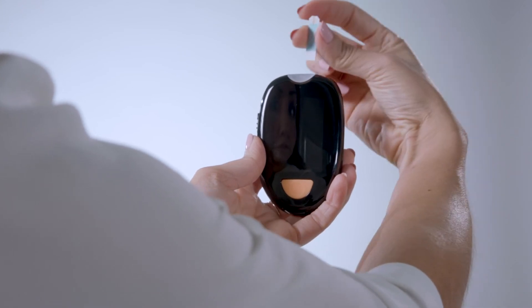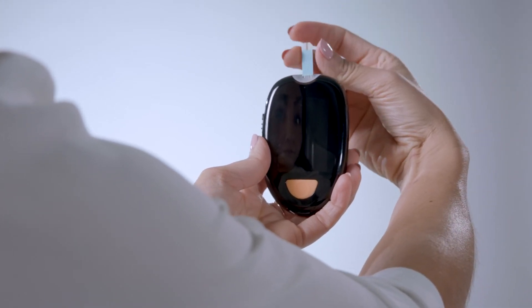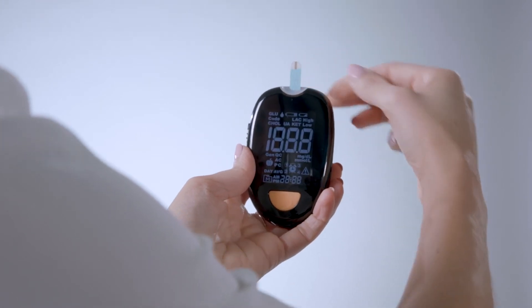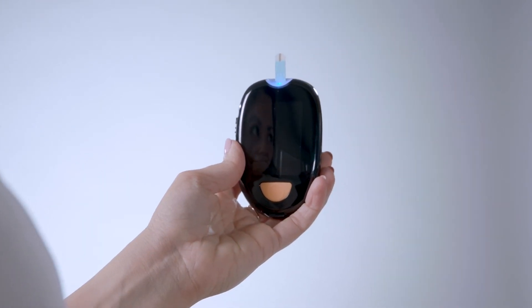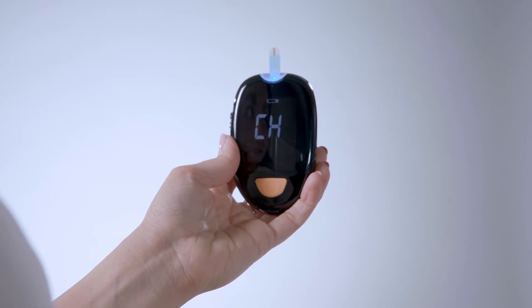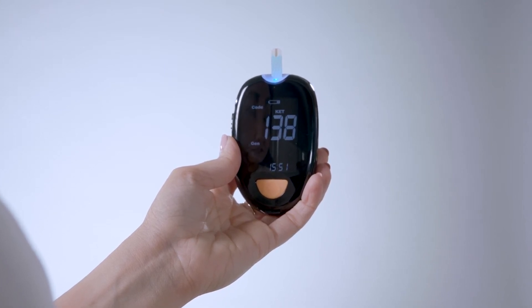Open a test strip package and remove it. Hold it on the sides and avoid touching either end. Insert the end of the strip with the contact bars into the meter to turn it on — the single absorbent end of the strip is exposed. Wait for the meter to display a blinking blood drop.